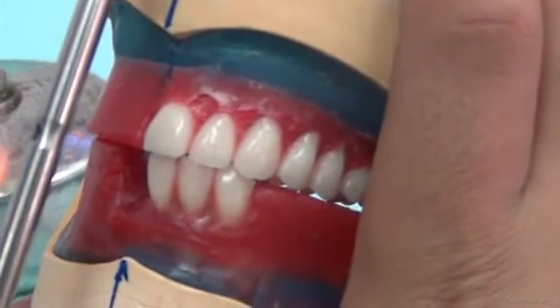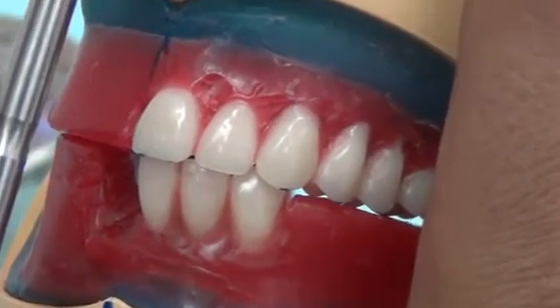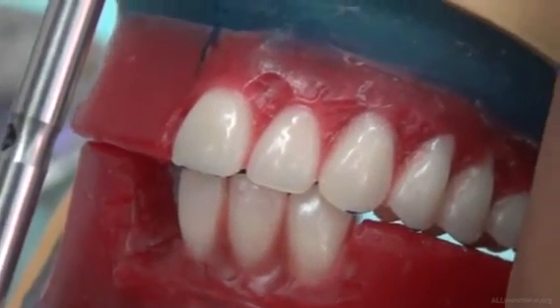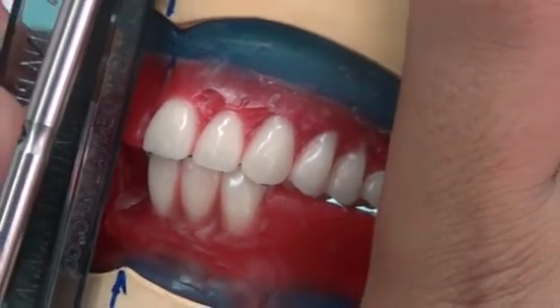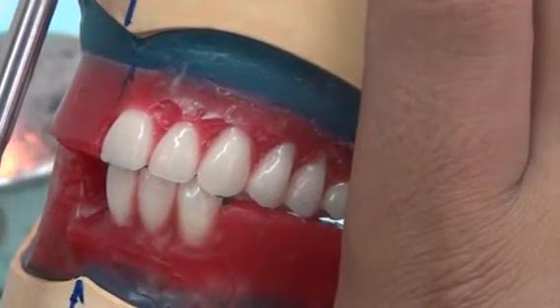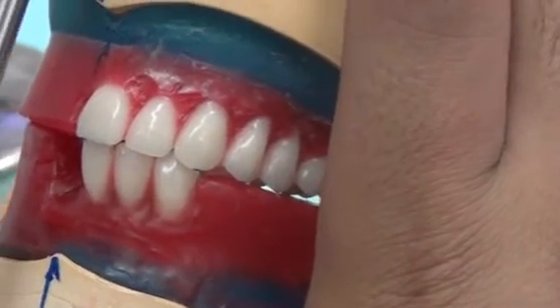So we're going to just look at them in a final view. You may notice that the midlines are together, comparing the upper cast midline with the lower cast midline. And of course these should have been straight when you did the mounting. So the mounting itself should have had the midlines all together.